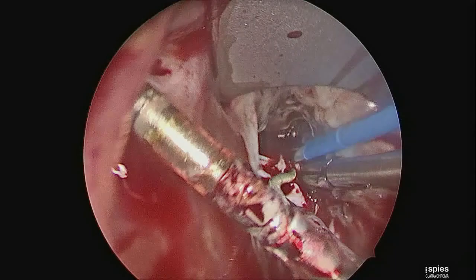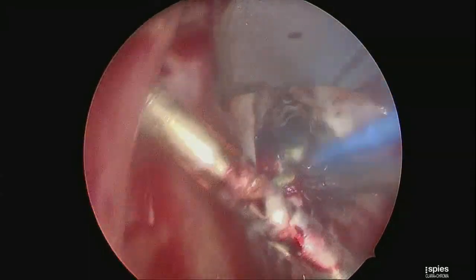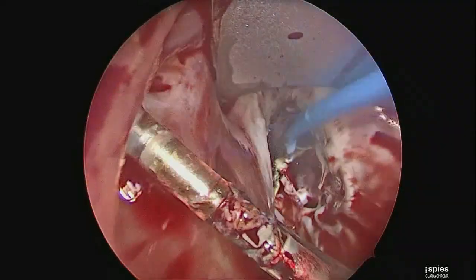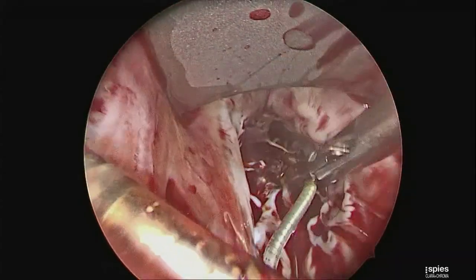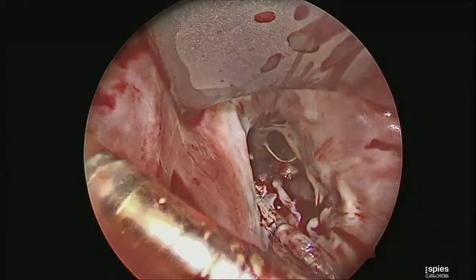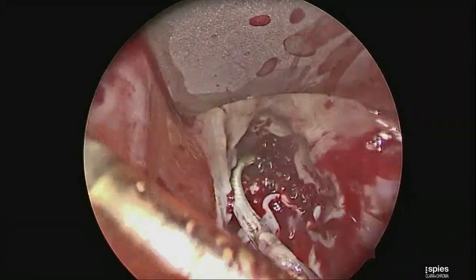Once the lead was released, the plan was to secure it in the commissure between the septal leaflet and the posterior leaflet using a bicuspidization technique. One can see here the lead is now free and the valve will be tested. The septal leaflet mobility is much improved.